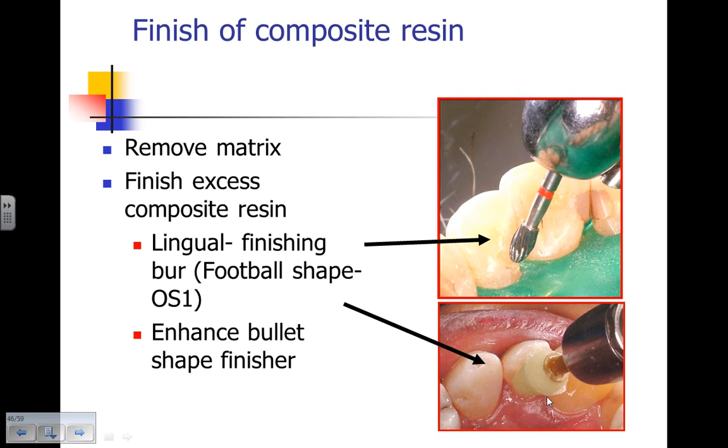It's an egg-shaped finishing burr. You'll hear football shape, but if you're from Europe or from Latin America, football is soccer, and soccer is a round ball.